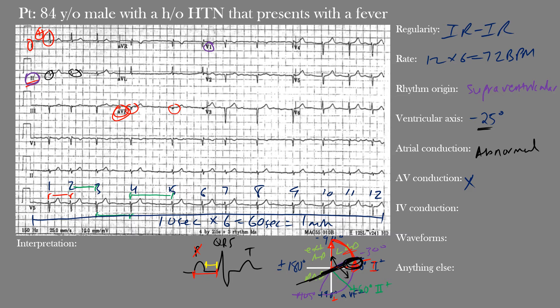How about intraventricular (IV) conduction? We look at the duration of the QRS complexes. The normal QRS duration is between 70 and 110 milliseconds, or about two to three small boxes. The main thing we're checking is whether the QRS interval is prolonged. We can see narrow QRS complexes throughout the EKG appearing within normal limits — the actual QRS duration here was 88 milliseconds, which is within the normal range of 70 to 110 milliseconds. So we have normal intraventricular conduction.